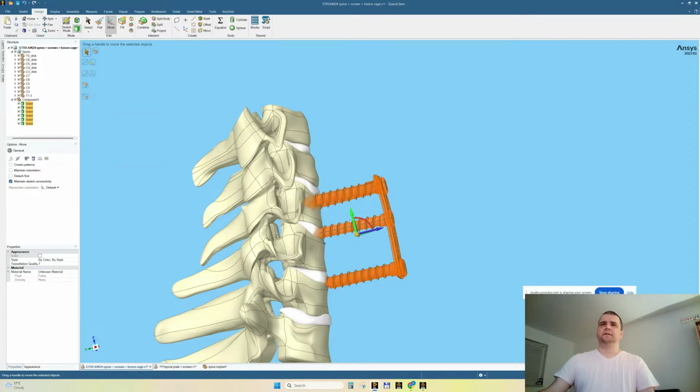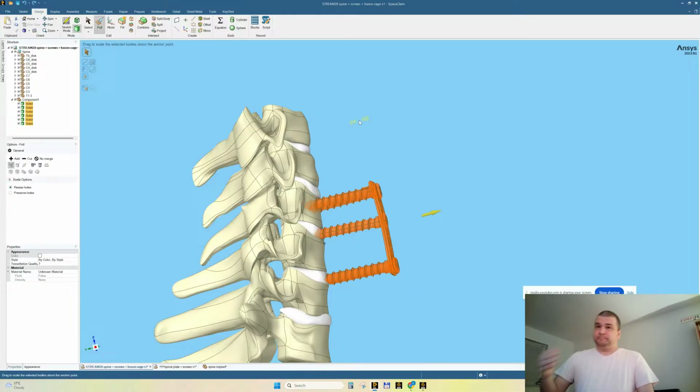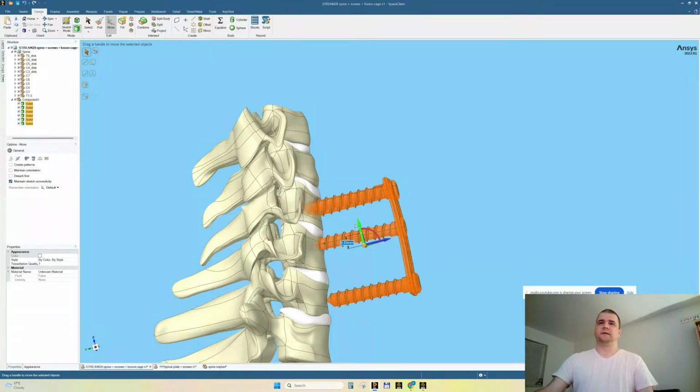Here move, and my goal is to have the screws in the middle of the vertebrae. And here it's not so much. So Control Z or undo. Let's hit it with 1.25. Because the previous 1.1 was not enough, now I have modified to 1.25. Let's move, and we should be nice finally. Yes, we're very good.